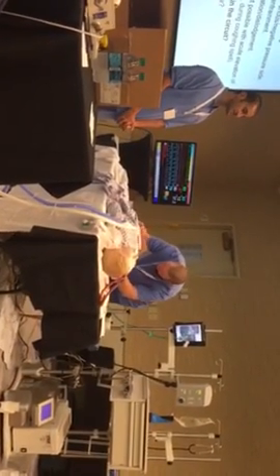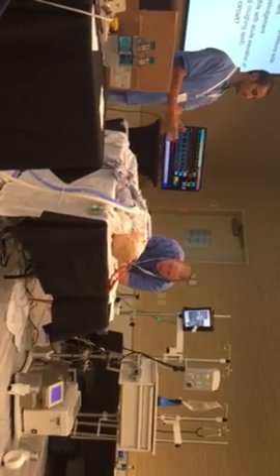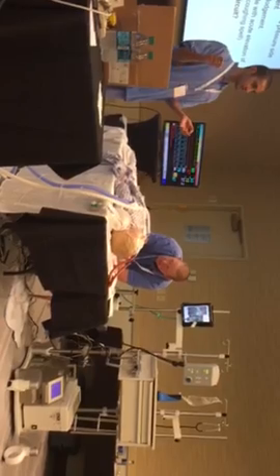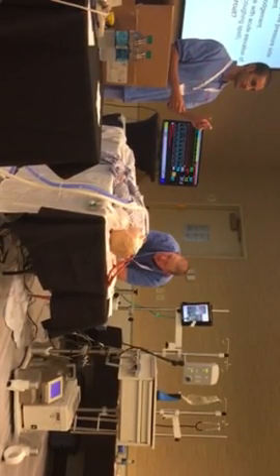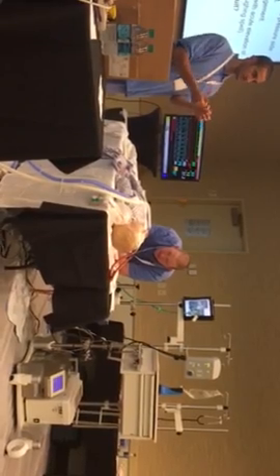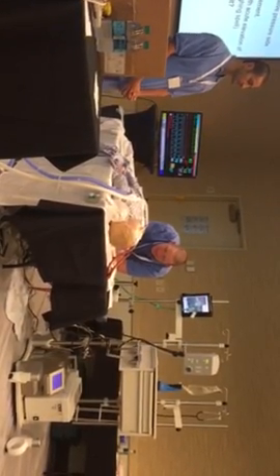And placing central lines for a patient on ECMO, there's always a risk of air entrainment. Especially when we put central lines in, we take the guide wire out, that port is open briefly. So you really have to be cognizant. You can't leave it open. You take the wire out and quickly clamp it. So the person doing a central line has to be aware of that.